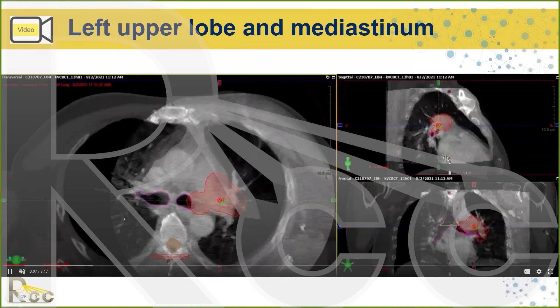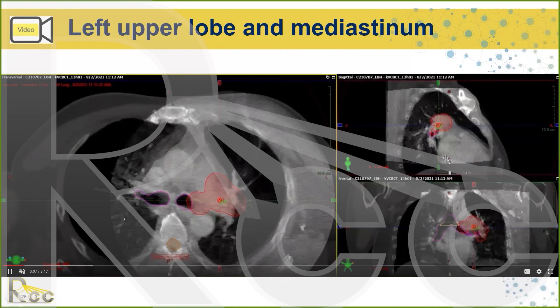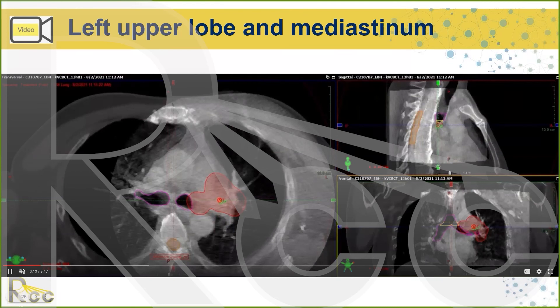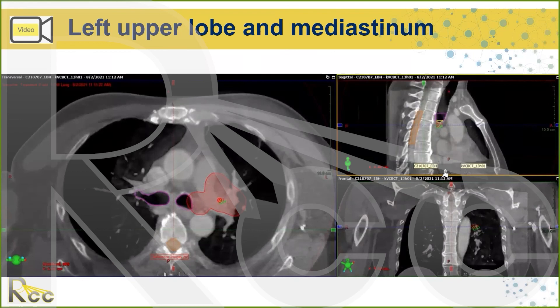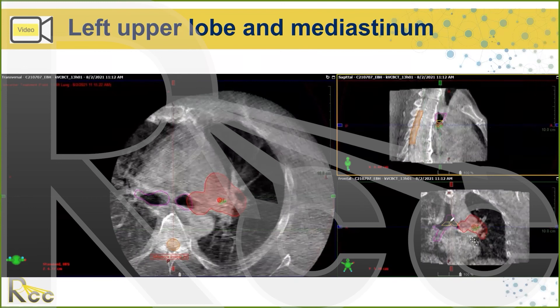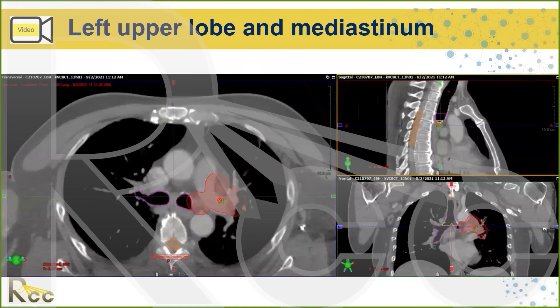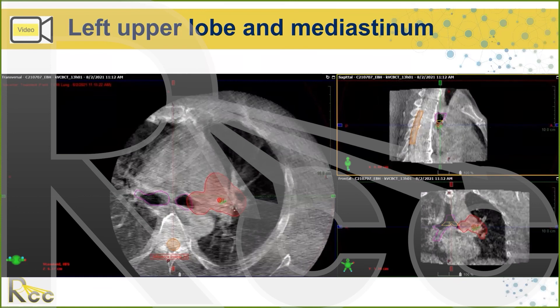The chest can be a challenging site for image registrations. If you don't have the apex of the lung clearly visible, it can be easy to mismatch in and out because the thoracic vertebrae all look alike, and the carina can move relative to the thoracic vertebrae. However, the apex of the lung and the disc spaces are your friends — just like in KV matching, you look at discs to get your in-and-out position lined up.